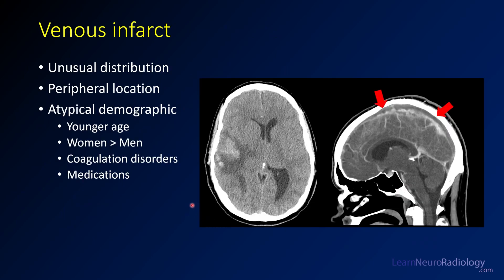Venous infarct is another cause of hemorrhage that can throw you off. It's often in an unusual distribution — if you see a peripherally located hemorrhage, particularly at a cortical or subcortical junction, think about venous infarct. These patients tend to be younger women and may have coagulation disorders or be on medications that increase clotting risk, such as hormonal contraception. In this example you see a peripheral hemorrhage, and on a CT venogram there's extensive thrombus in the superior sagittal sinus — the hemorrhage resulting from overpressure in the associated veins.